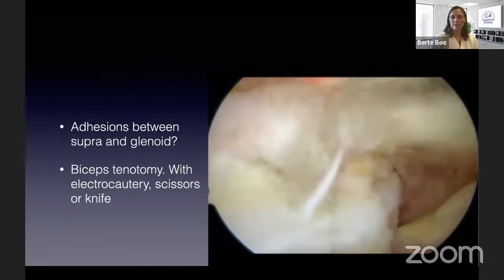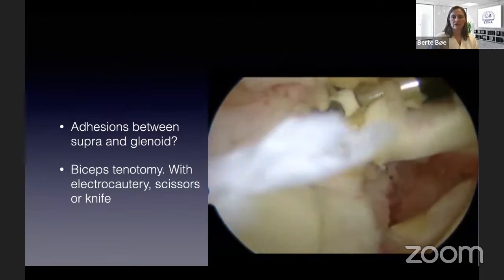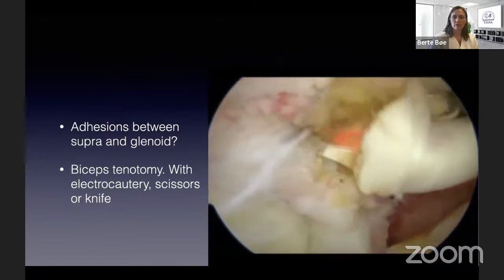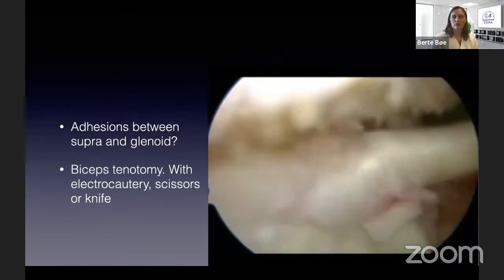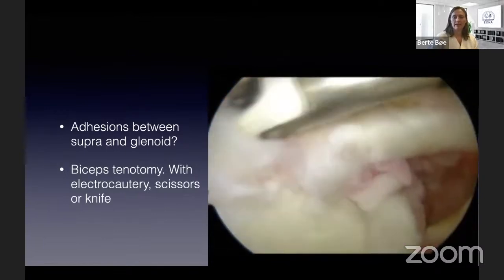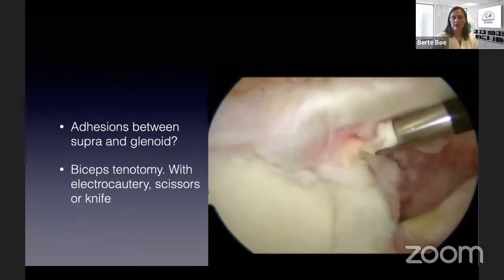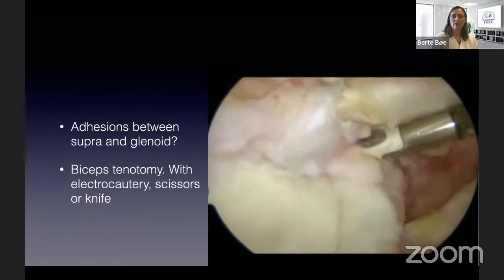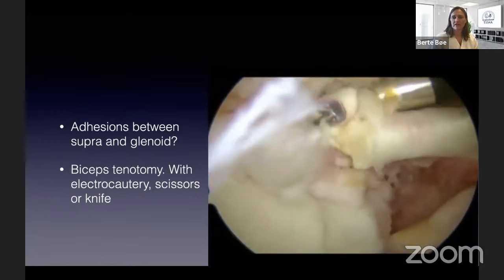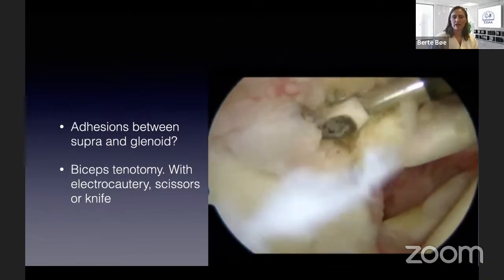Of course, you can do your biceps tenotomy with a scissor or a knife, but when you're already in there with your electrocautery, it's also just a few seconds to do it with the electrocautery. And of course, you have to be careful not to go too far medial in this situation, because then you might injure the suprascapular nerve. So I look at my electrocautery device and I know it's approximately 1 centimeter until the black mark. So I know how far in from the edge of the glenoid I have moved.